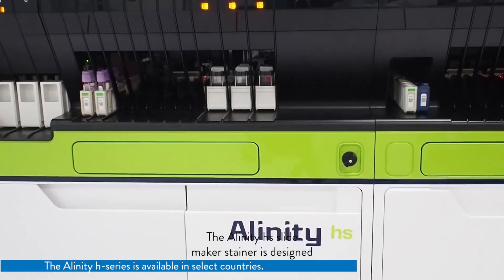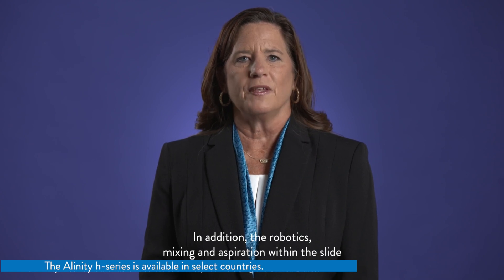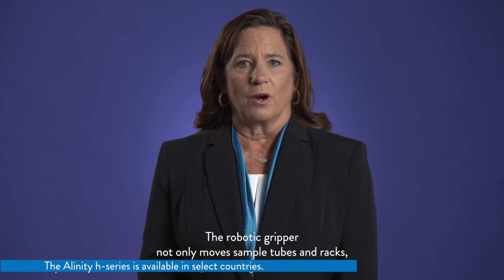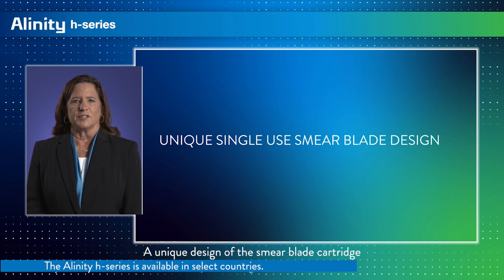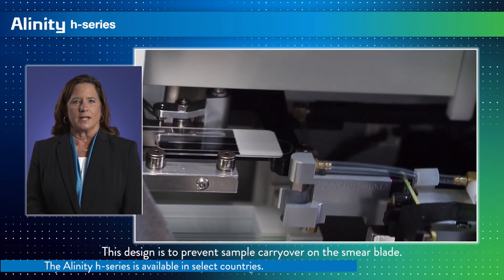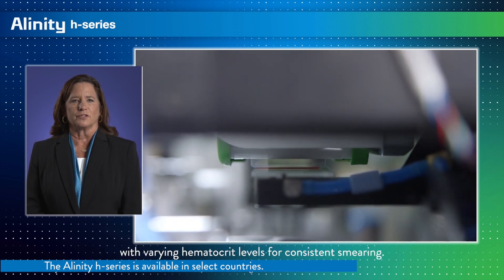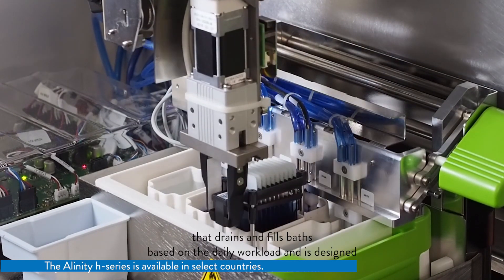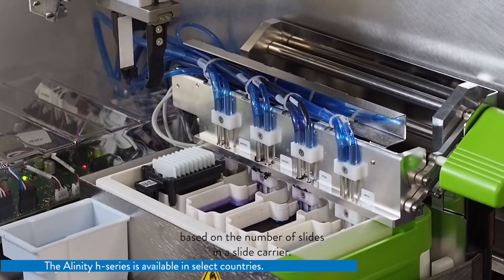The Alinity HS Slide Maker Stainer is designed to connect directly to the Alinity HQ module. The robotics, mixing, and aspiration within the Slide Maker Stainer module are nearly identical to those in the Alinity HQ analyzer. The robotic gripper not only moves sample tubes and racks, but also slide carriers throughout the staining process. A unique design of the smear blade cartridge provides a new, clean smear blade when making every slide, preventing sample carryover. The smear blade can also adjust for samples with varying hematocrit levels for consistent smearing. The staining reagents are delivered through a fluidic system that drains and fills baths based on daily workload, and is designed to automatically adjust the reagent depth in the bath based on the number of slides in a slide carrier.